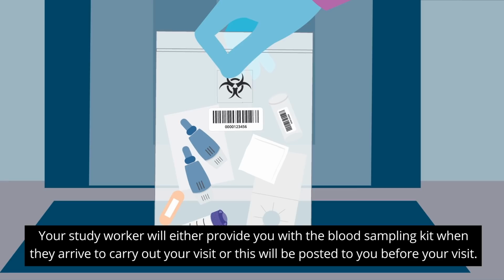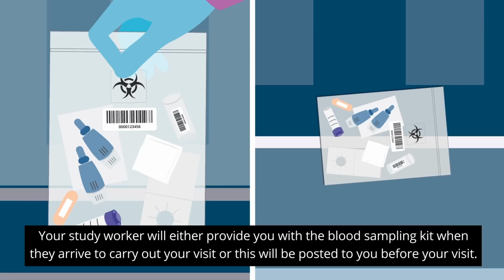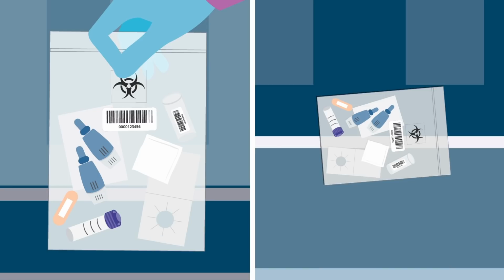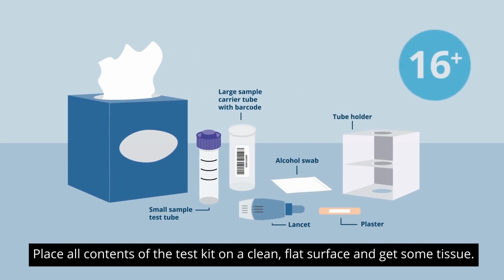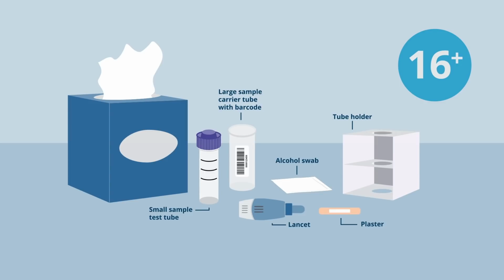Your study worker will either provide you with the blood sampling kit when they arrive to carry out your visit, or this will be posted to you before your visit. If you get the kit through the post, please do not use it before the study worker arrives on the day. Place all the contents of the test kit on a clean, flat surface and get some tissue. This kit may only be used by adults 16 years and over.